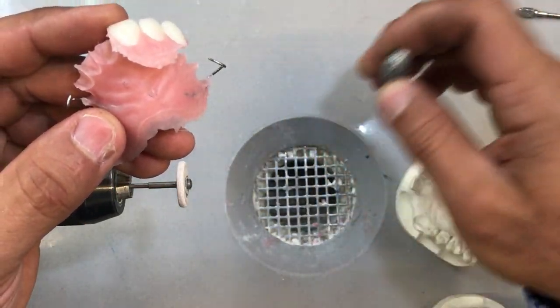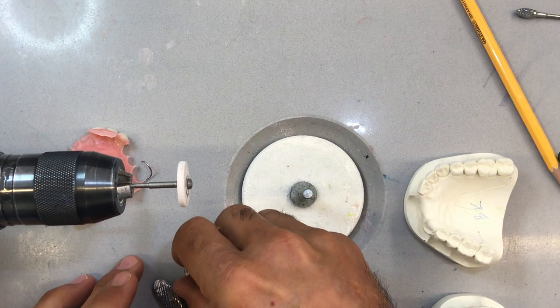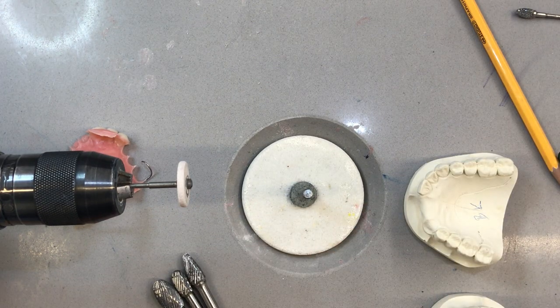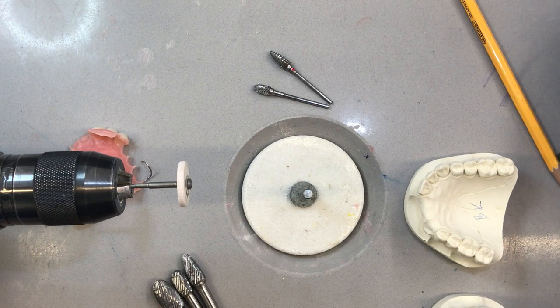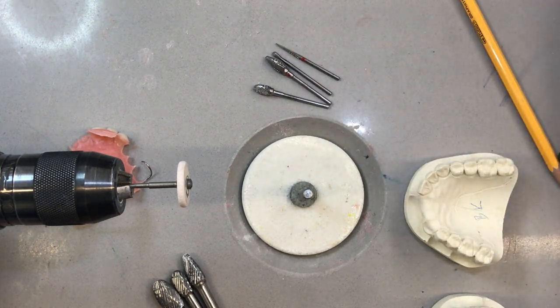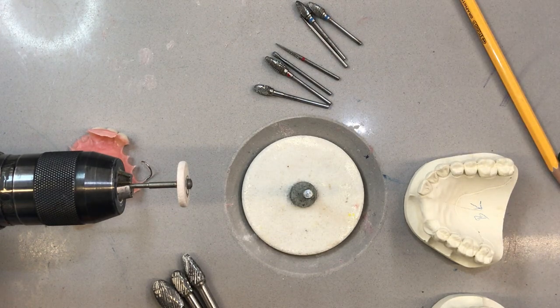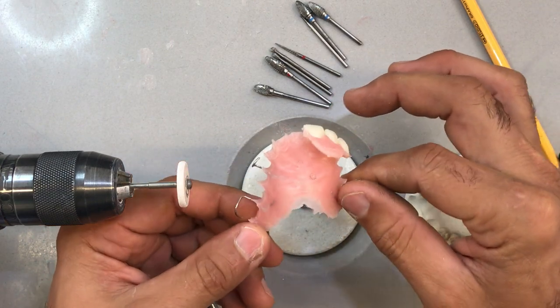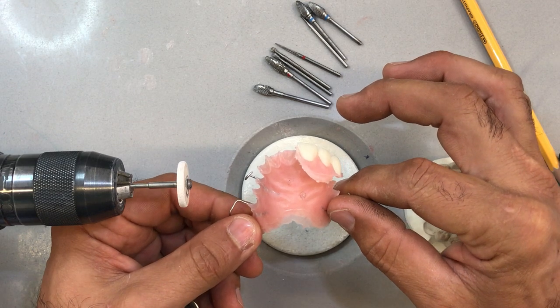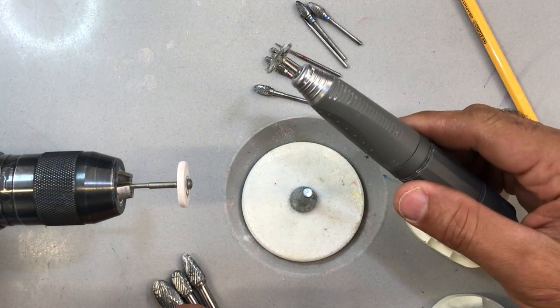I'm going to use an array of burrs: this big stone grinding wheel, a large and small egg burr, a tapered burr, and a whole bunch of little ones in various sizes that I can fit on my handpiece to get into smaller areas. Eventually you're going to build up an arsenal of burrs that will help you trim all the little fine areas for every different scenario. We're going to start off with our larger burr and make our way down into something smaller, eventually utilizing the handpiece as well.